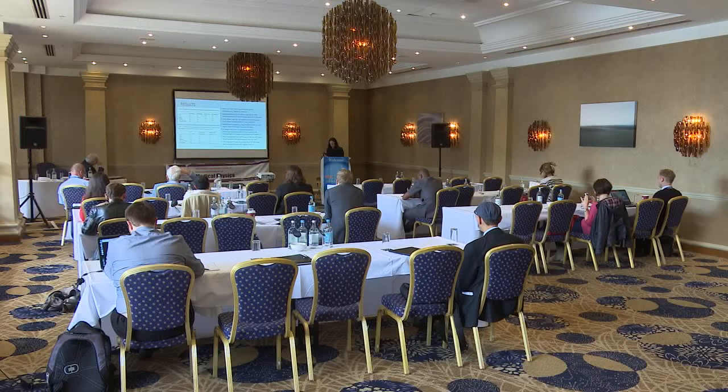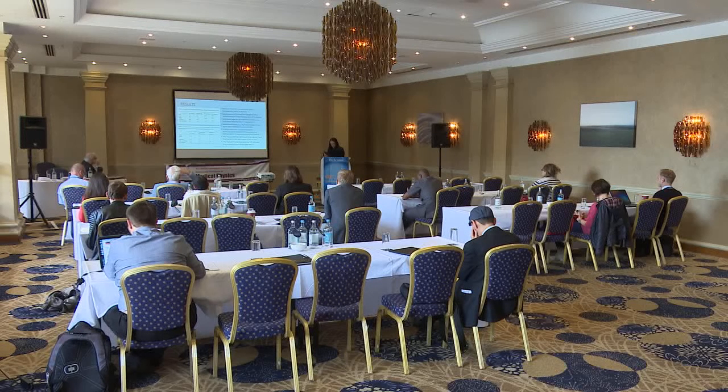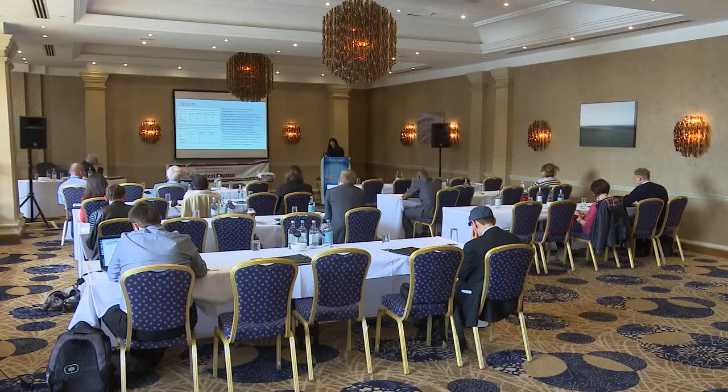A large variation in radiation dose, fluoroscopy time, and in the number of radiographic images was observed in the study, as seen in Table 2. During ERCP, patients receive on average 2 gray in square centimeter of radiation dose, and the highest dose area product value recorded in the study was over 9 gray in square centimeter. The mean fluoroscopy time was found to be 1.7, ranging from 0.4 to 7.8 minutes. The number of radiographic images taken during ERCP varied from 0 to 9 images, and the mean number of images was 3 in this study.